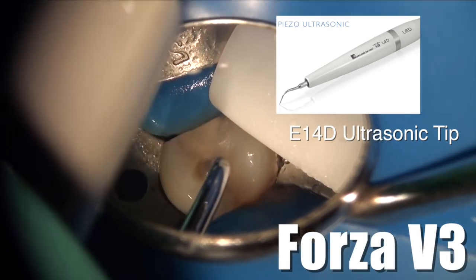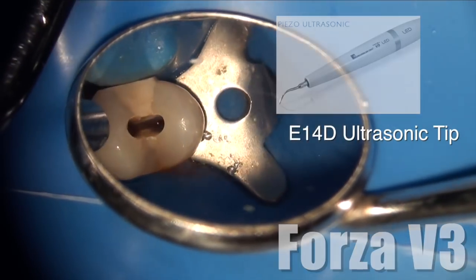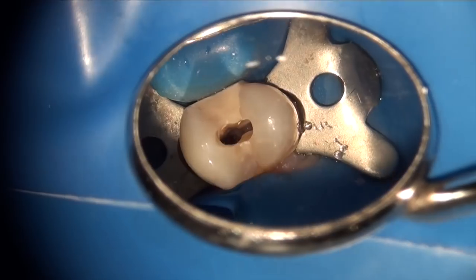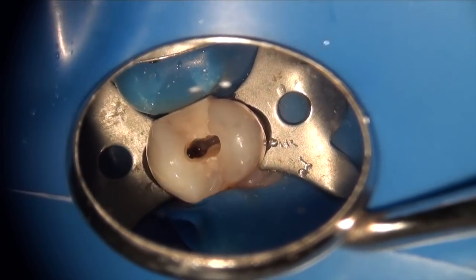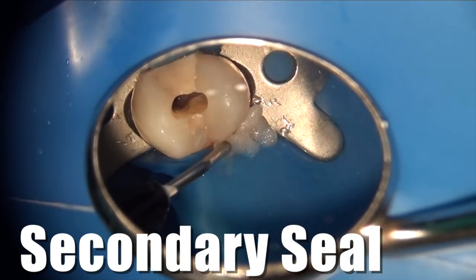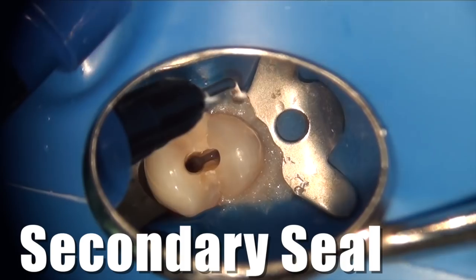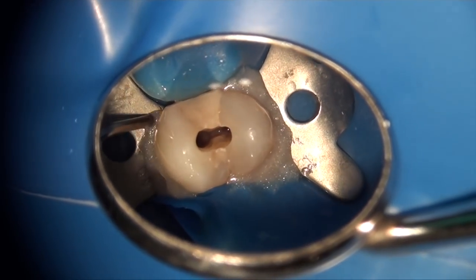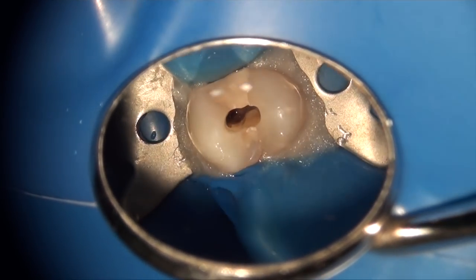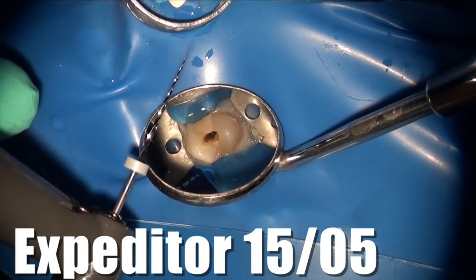The goal of your access preparation is to have straight-line access to the mid-root portion of the tooth, and creating a straight-line access at this point is really essential. You can see both the buccal and the lingual canal after this access preparation, which means the primary part of the access is done. Now it's time to create our secondary seal and get better isolation, because the primary seal is your rubber dam — that just prevents the tongue and gross saliva from getting into the field. I do my secondary seal a little bit later once everything is settled, sealing in the crevicular fluid seepage that usually occurs around the rubber dam clamp.